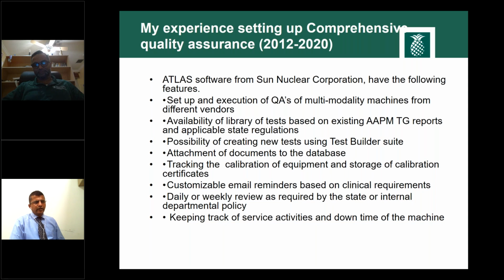Okay, so you use ARIA for that purpose? Yes, the patient-specific QA goes into ARIA documentation. Physicists sign off, physicians see it. Physicists approve, actually. All right, thank you.